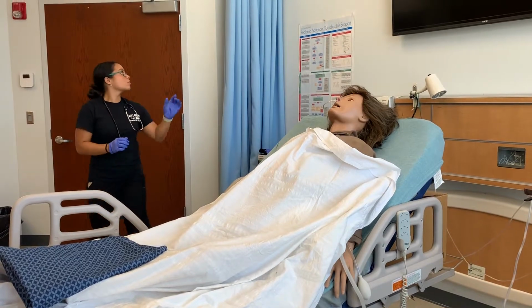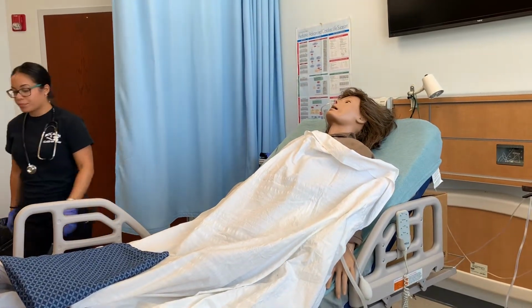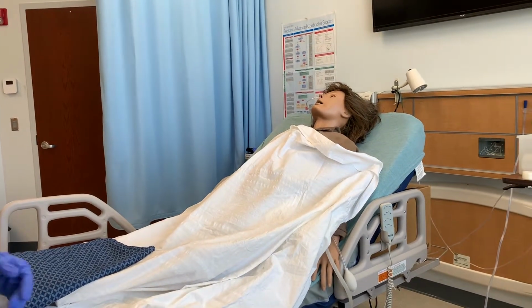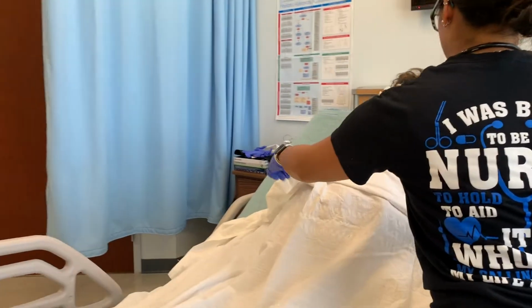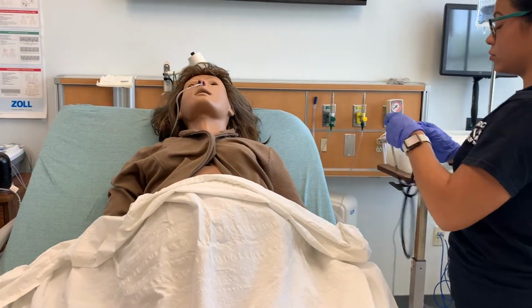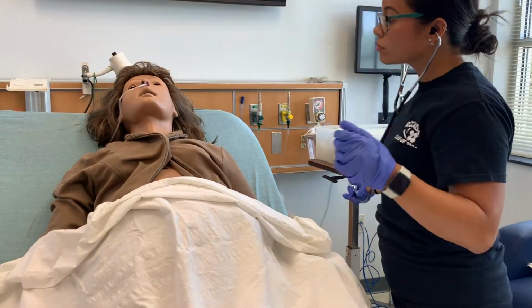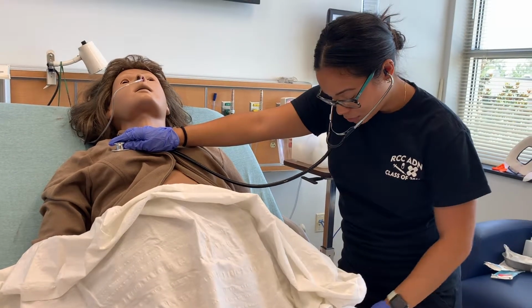Provide for privacy and assess the patient. Determine the ease of respirations, breath sounds, respiratory rate, rhythm, and depth, oxygen saturation, and chest movements every 2 hours.